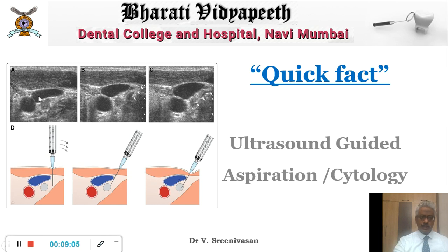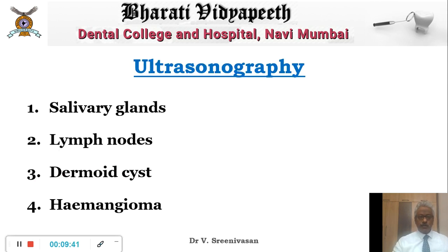So you can see that there are 3 cavities here. This is the least, this is hypoechoic, and these 2 are anechoic, and you want your needle to reach. So the needle goes down here and is right over here and is able to aspirate what you want. So ultrasound guided aspiration becomes very safe because you don't need to use any form of radiant energy. There's no ionizing radiation used, and yet you get a very precise localization from which you can get a representative tissue.